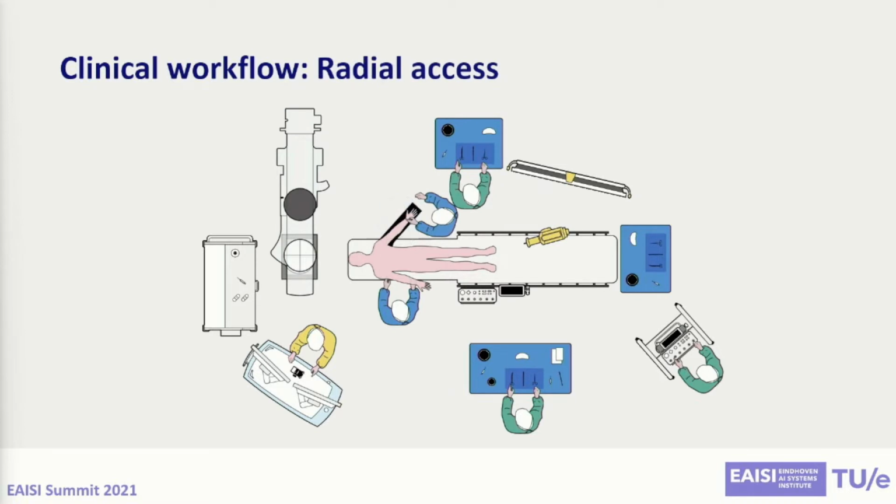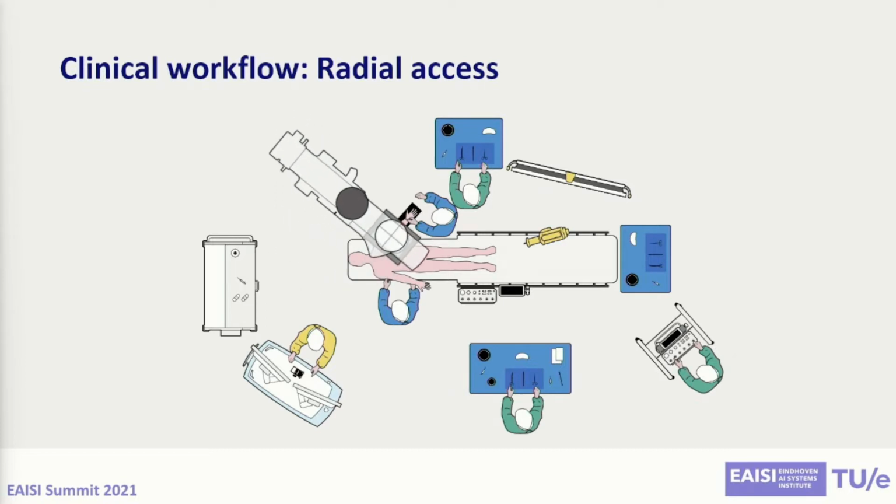One step further, we are going to perform a radial access. So we are going to actually bring the robot from the parking position close to the arm, such that the procedure actually can start. So the robot has to navigate from the parking position to the arm.